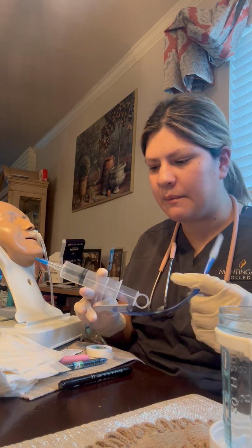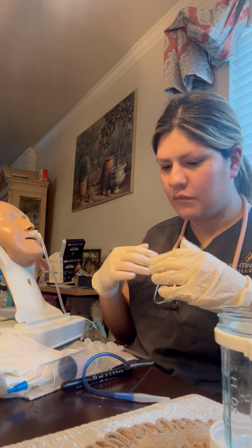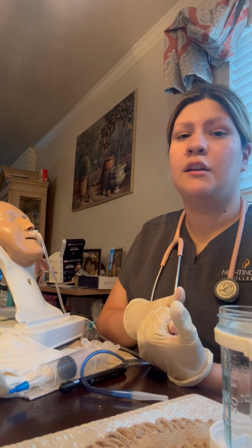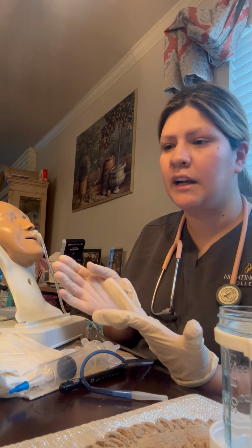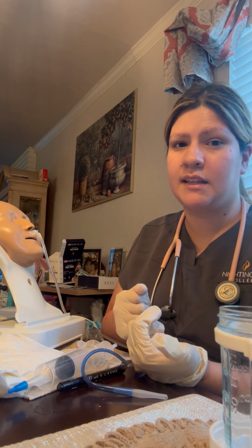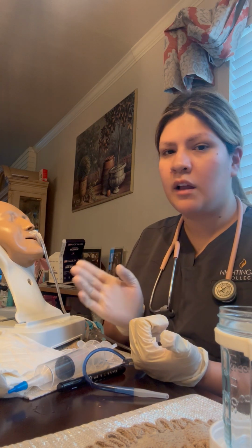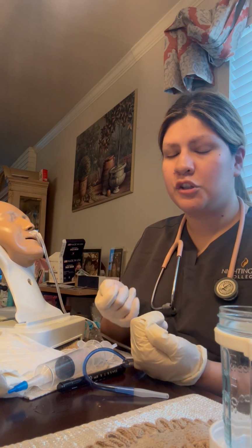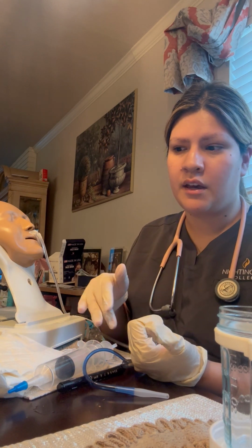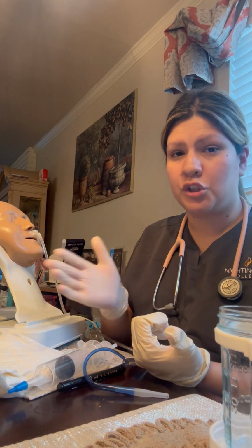So you could check placement by pushing in about 30 milliliters of air, or 30 cc's of air, and then drawing back about 5 to 10 cc's of stomach content or gastric contents, as well as when you're pushing in the air, you're listening to the stomach and making sure that it's like a nice whooshing sound.